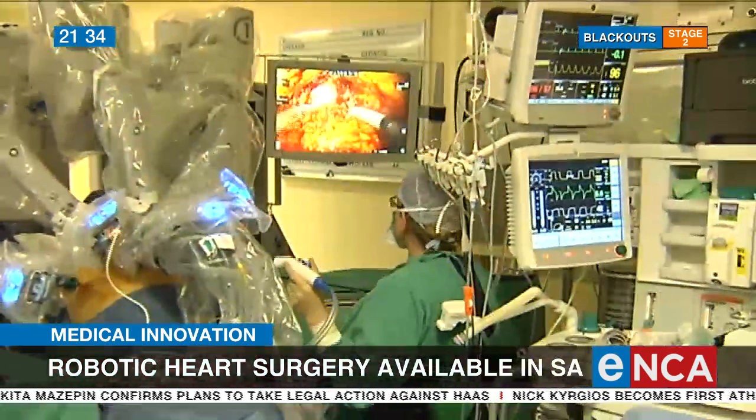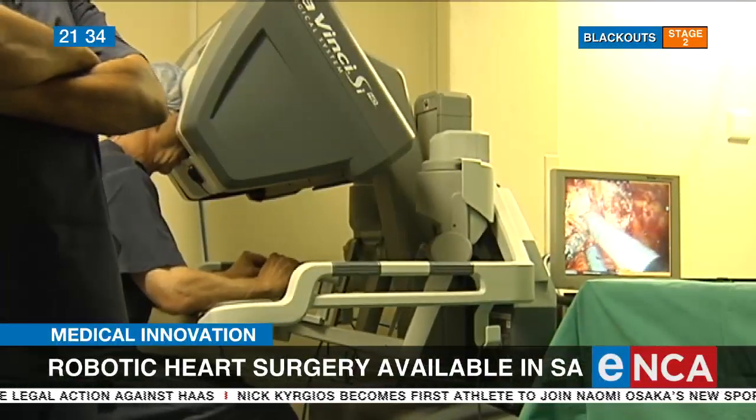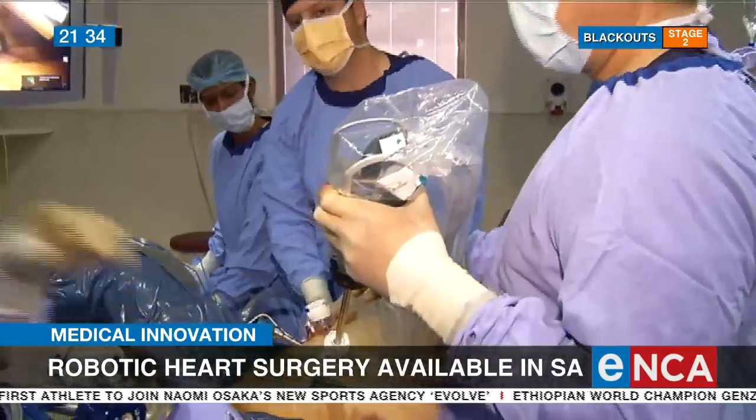In short, robotic surgery is basically the normal cardiovascular and lung surgery that we would offer any patients. But we perform it now with state-of-the-art robotics technology, which consists of a robot at the bedside of the patient, at the operating table, and a surgeon who sits at a console a few meters away from the patient. We use that console to function as an extension of our hands, with fantastic tactile feedback and excellent three-dimensional vision, to perform exactly the same operations that we would usually do, just with smaller cuts and being less invasive.